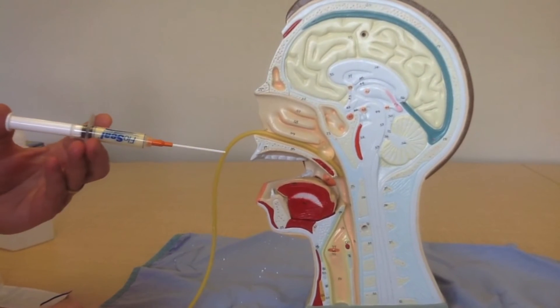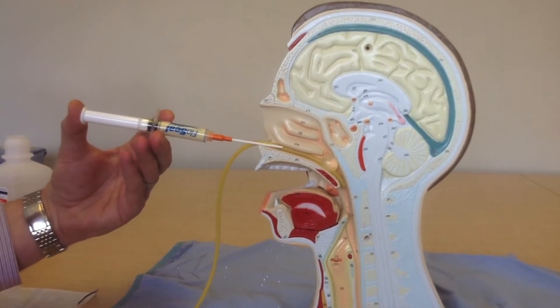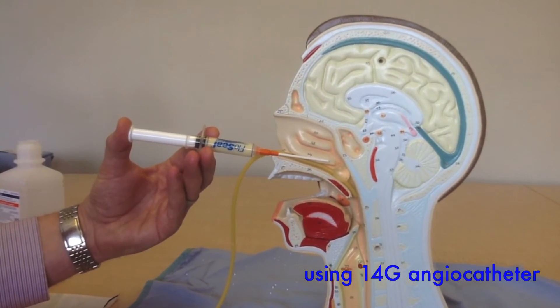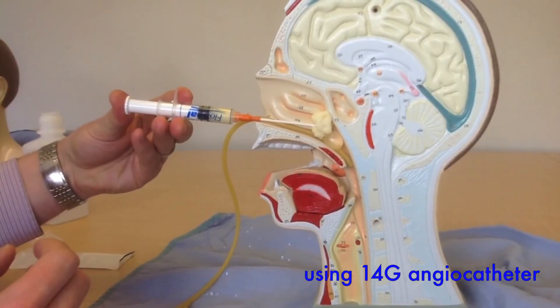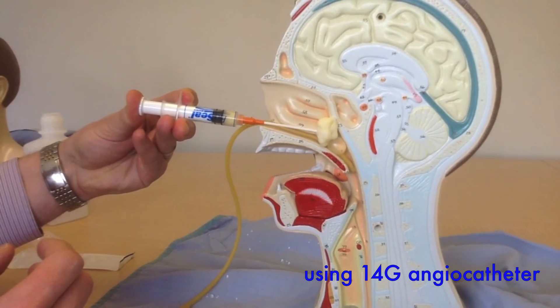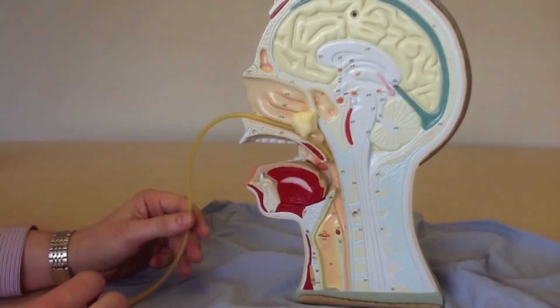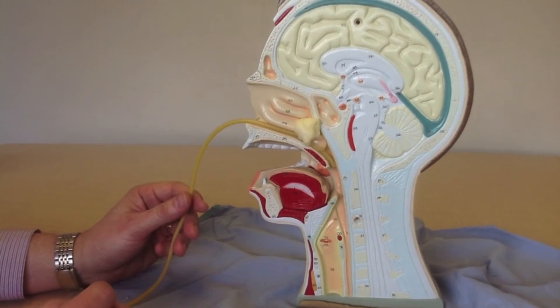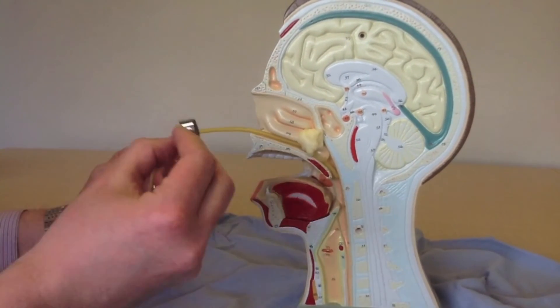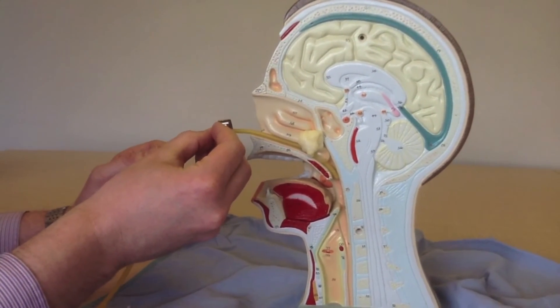Once the Foley catheter is correctly positioned and the patient is still actively bleeding from their epistaxis, the catheter to deliver the flow seal can be inserted in the nasal cavity along the floor of the nose to the back of the nose. Once in the correct position, deploy the flow seal using all of the contents of the syringe into the posterior nasal cavity. Have the patient tilt their head backwards 10-15 degrees while securing the Foley catheter either with your hand or with a clamp applied with sufficient padding around the nares. Have the patient stay in that position for 10 minutes.